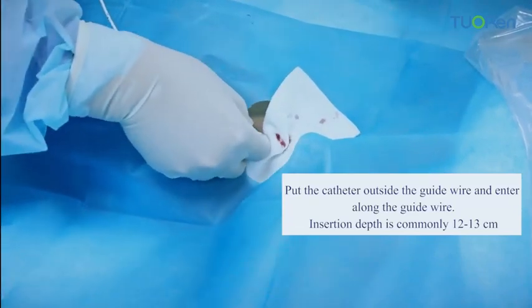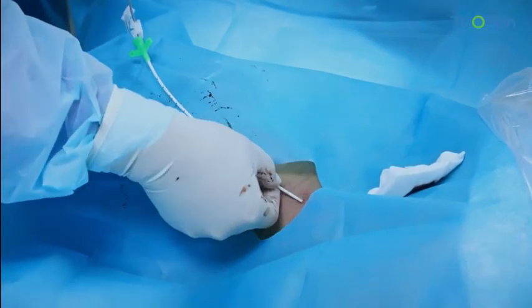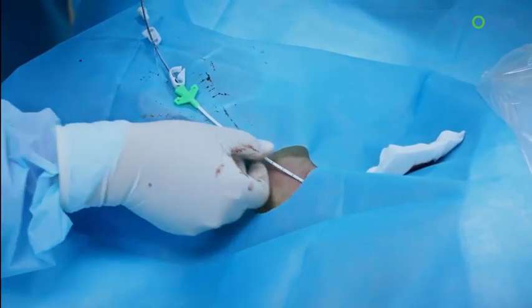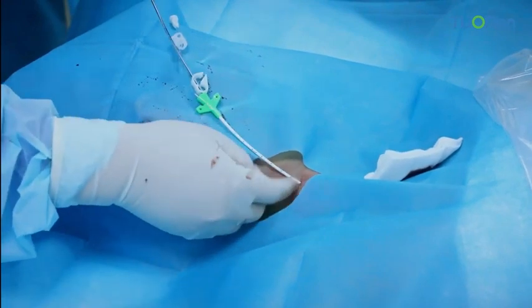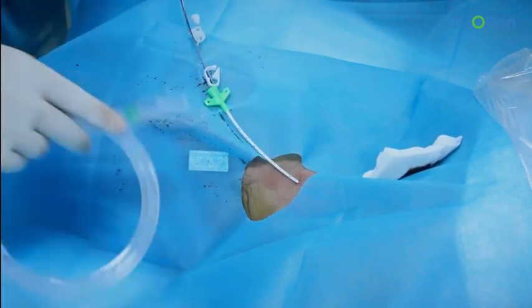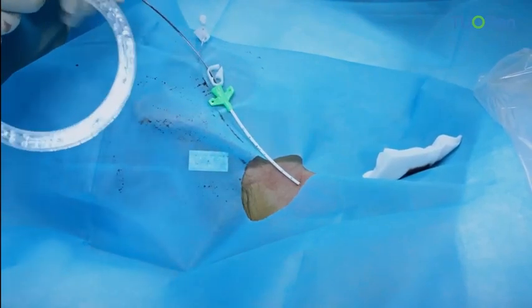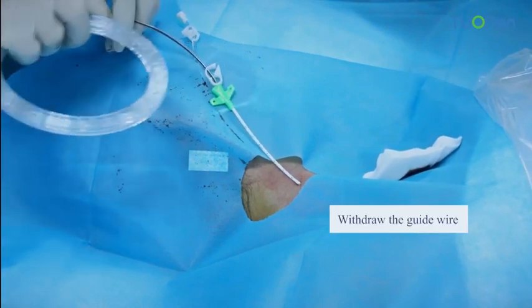Insertion depth is commonly 12 to 13 cm. Withdraw the guide wire.